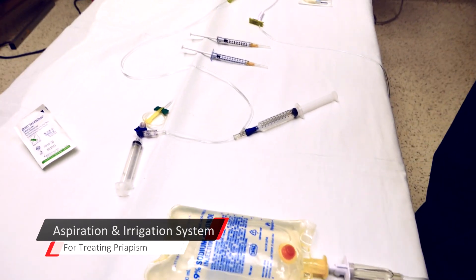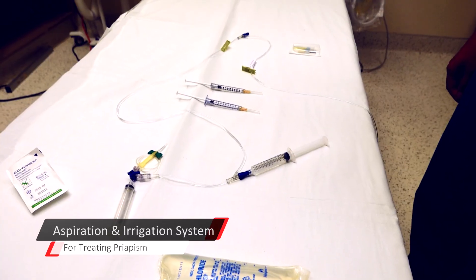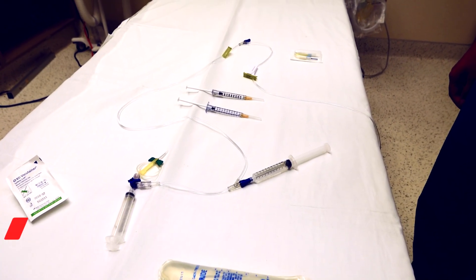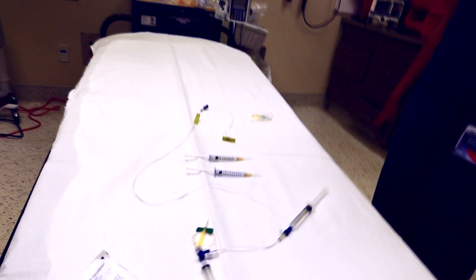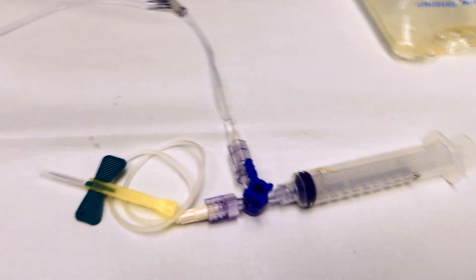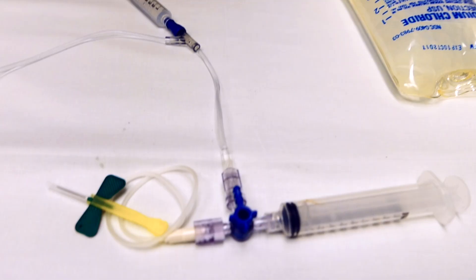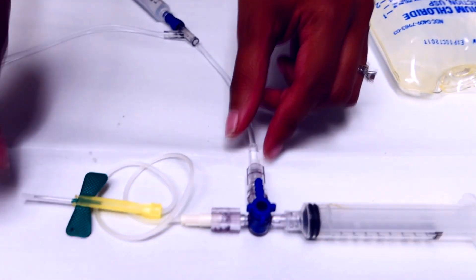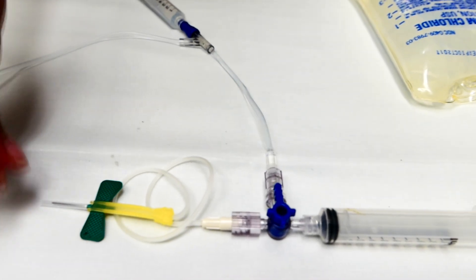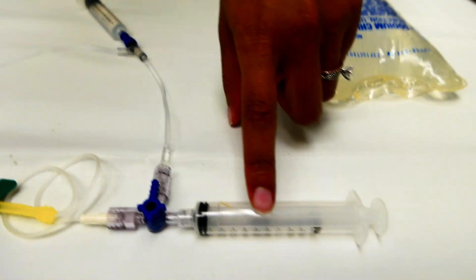We're going to do a short video on one way of setting up your IV tubing for aspiration and irrigation of a case of priapism. Attached to the three-way stopcock we have a 21-gauge butterfly needle. What's this syringe used for?